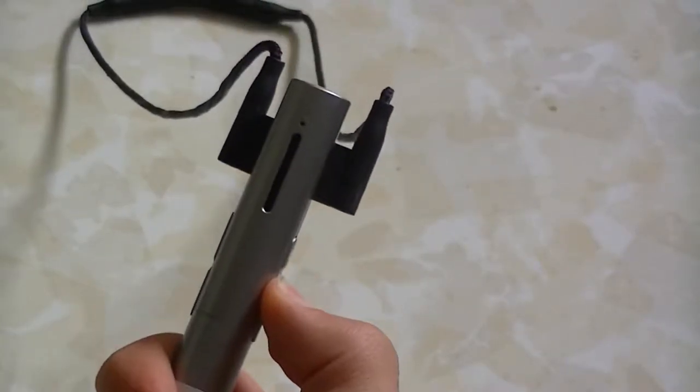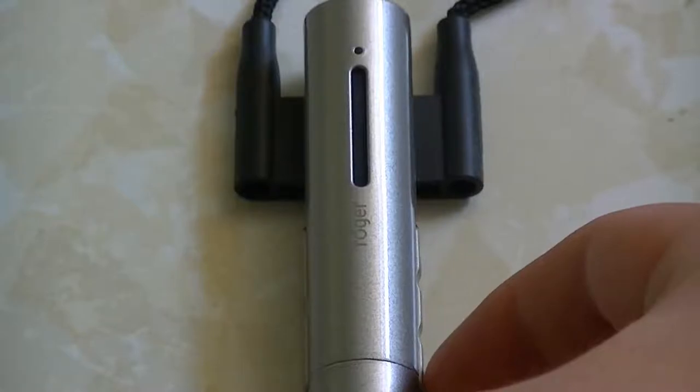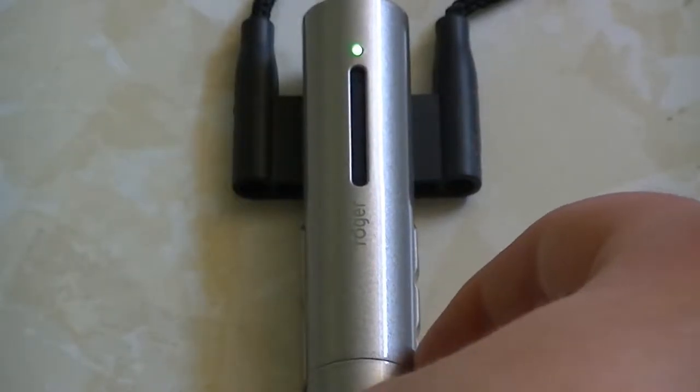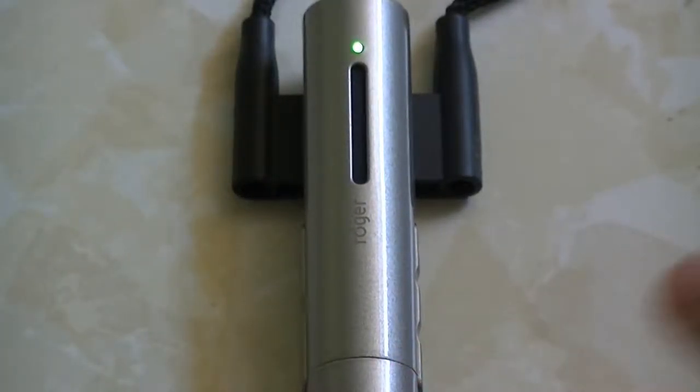You can switch the mode by pressing the bottom-most button on the right side with the mic icon. Don't worry about the middle button — that's to pair or re-pair the mic with the hearing aid receiver. If you press the mic button once, the LED indicator will blink purple once; press again, it blinks twice; again, three times; and again, it stops blinking — that's how you switch between the three modes. By default, it's on automatic mode, which has a blinking green LED and automatically switches the mode depending on the orientation of the mic. It's okay to leave it on automatic mode, because it'll switch accordingly.